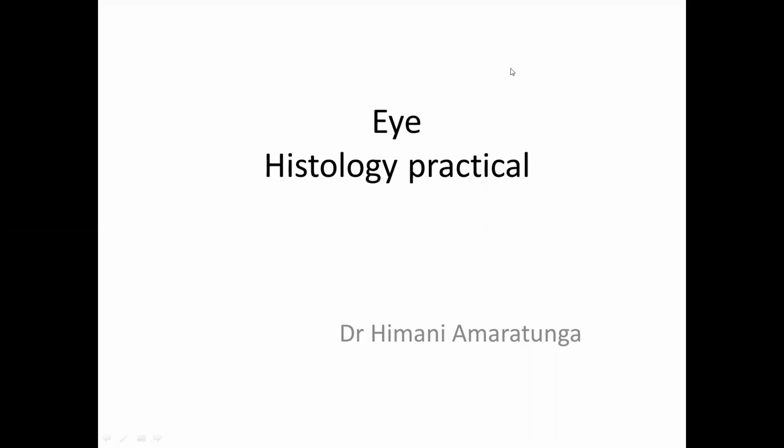In this video, we'll talk about a few of the slides which you will be seeing in the eye histology practical. There are only 4 slides here. When you come for your practicals, when the university restarts, we will give more slides and more time for you to go through the slides.